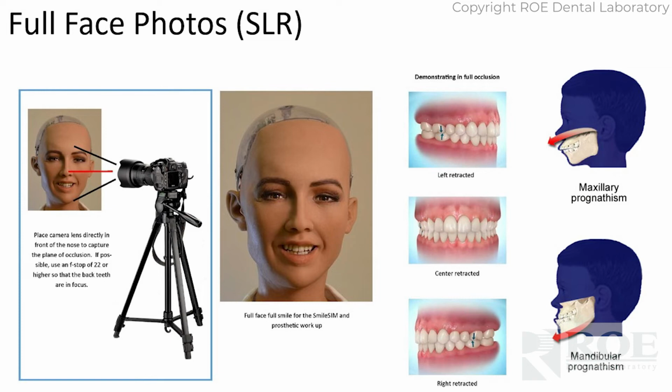And then one little trick is you can make sure that you can see the left and right ear about the same size. And then you can even see in our example here, the patient's looking a little bit to the left, right? You can see more of the right ear. And the reason we want this photo is because we develop some beautiful smile simulations. And really the only way to make an ideal perfect smile simulation is to start with a great photograph.